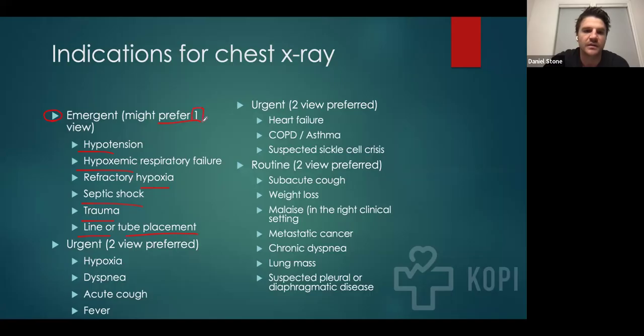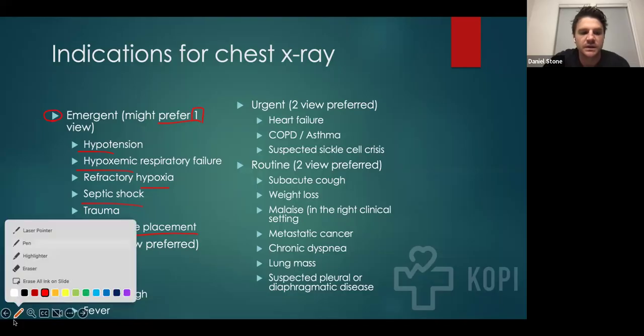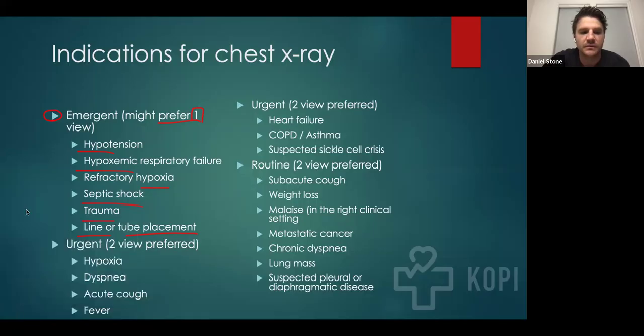preferably a one view. And the reason why is because you don't necessarily want a patient with these conditions to go to any imaging study. You want them to be able to get the test where they can be at the bedside. Urgent tests are a little bit different.